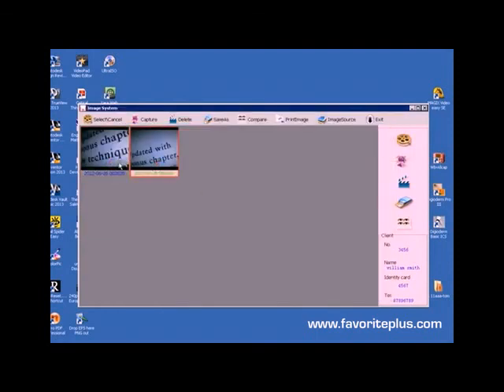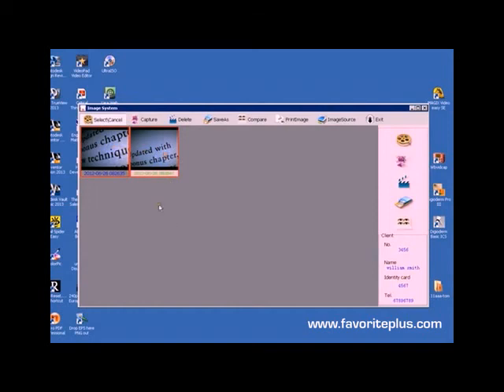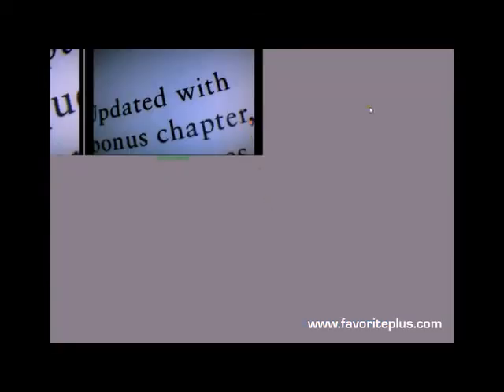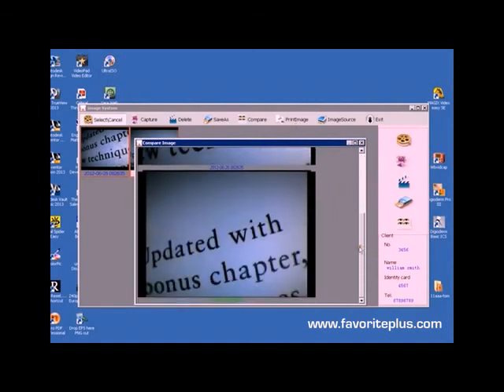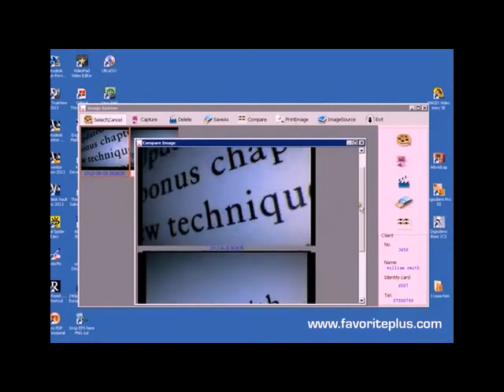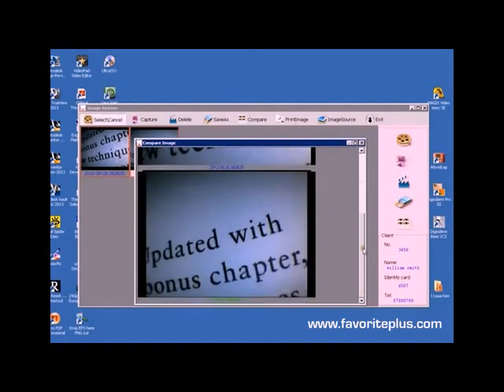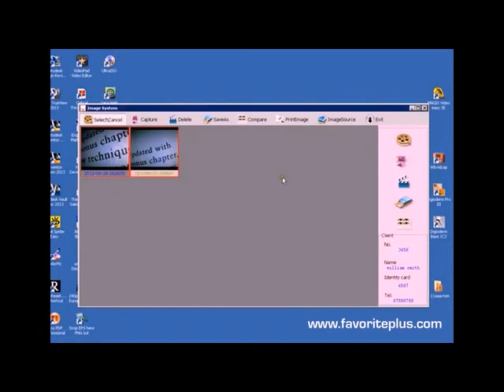You'll see you got the images captured there. Now there's many things you can do. If you click on the select, it means we can select images. So we can select both and we can click image compare, and you'll see that brings up a little image comparison interface where you can compare images over time.